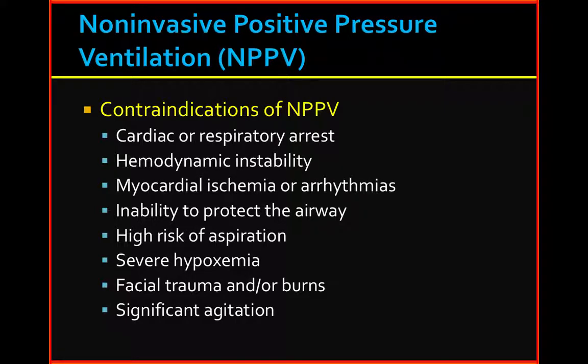So, our patient will continue to receive 500 cc tidal volume breaths at 10 times per minute, which will be synchronized to our patient's respiratory efforts. But the additional breaths will have unknown tidal volumes depending on our patient's effort and strength, with the assistance of our pressure support.